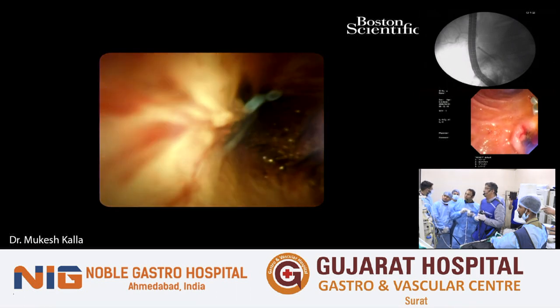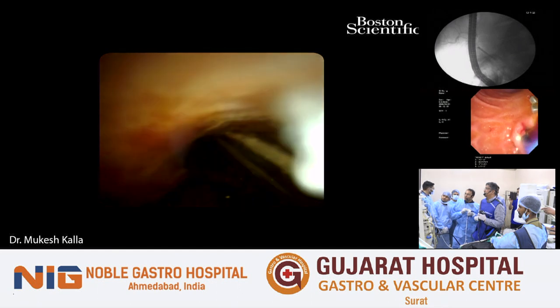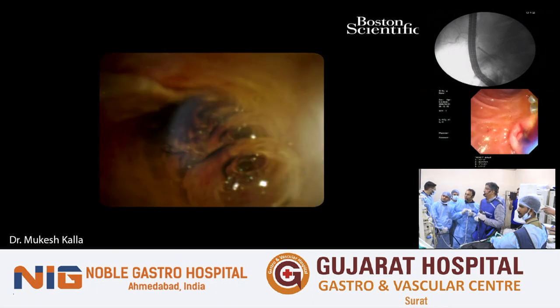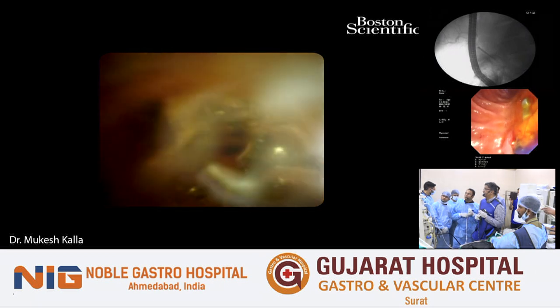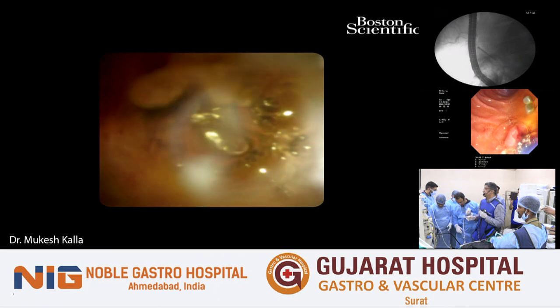Now we will try and locate, because we did a cholangiogram, and as per our cholangiogram, we should get our cystic duct somewhere around this place. Suction is needed, please do suction.